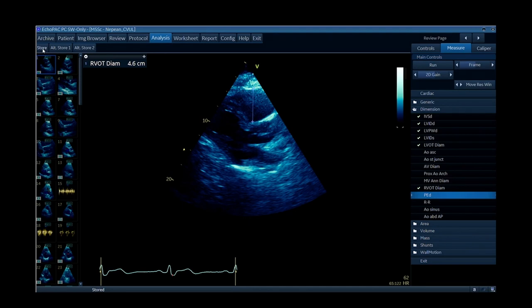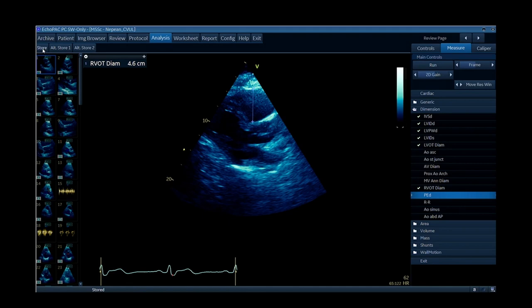Eyeballing it using the rule of thirds, it does look dilated. You can see how the septum is not completely horizontal — it's dipping down a bit — so you'd want to try moving up a rib space and repeating that measurement. The upper end of normal for the proximal RVOT is 35 millimetres. Here it's measuring 4.6 centimetres, which matches our eyeball, but I'd like to see that confirmed in more views.